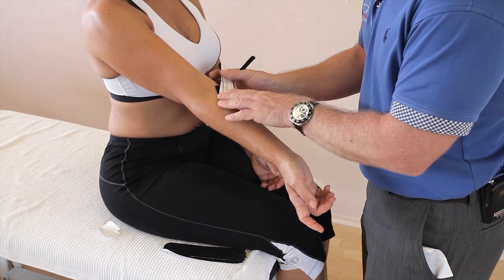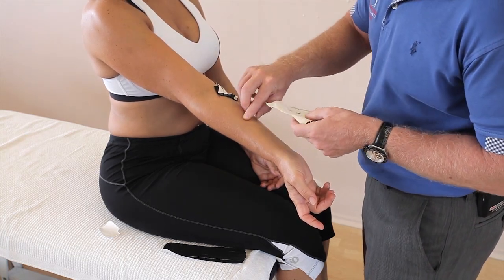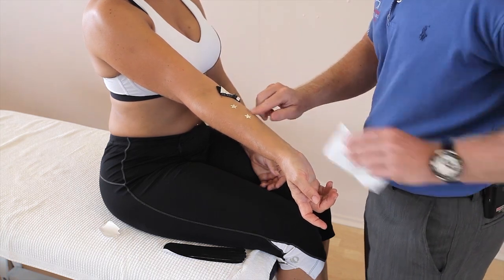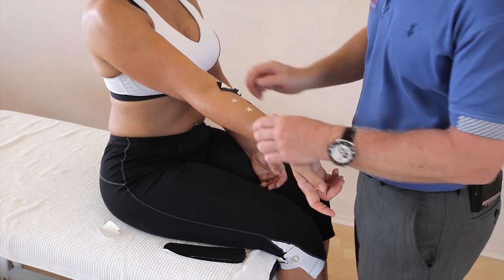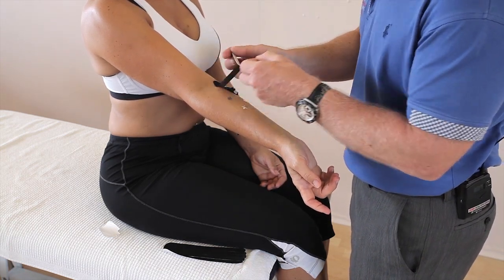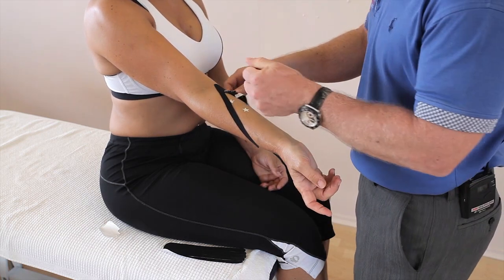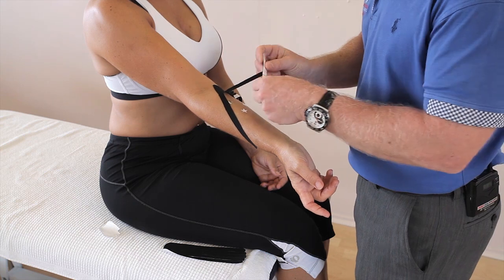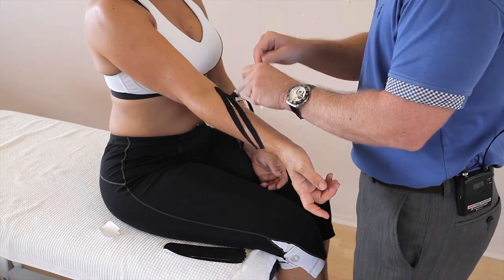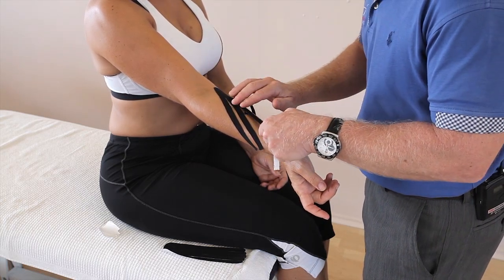If I just bring that back — imagine we've got the pain there. If I just identify where the pain is, if we have a tightness in the flexor muscles around that area, then we're going to try to offload this area. So each of the fingers — just pull it and then you can peel it, no stretch, just literally lay it down. And then the second one, peel it back. So just where this swelling is, where the pumping effect is. Fill that down with a little gap between each one.